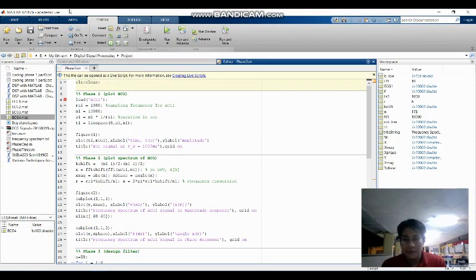Hi everyone, this video will talk about designing a filter to remove noise that corrupts the ECG1 signal given. So, from the data given, we use MATLAB to find its frequency spectrum. In order to do that, we find the discrete Fourier transform of the signal and transform it to the Fourier transform and plot the magnitude and phase spectrum.